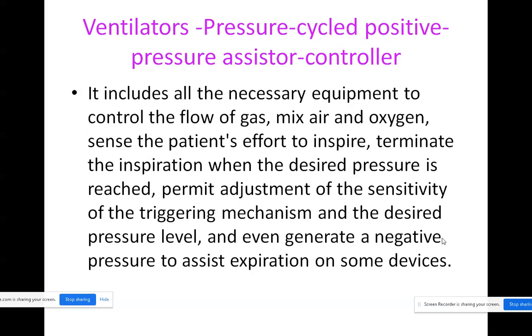Okay, it will be controlling the oxygen flow, and also mixing the air with the oxygen. It will also be sensing the inspiration of the patient. How much the patient is inspiring, that will be sensed. Based on that, it will provide the gas to the lungs, and it will also terminate the inspiration whenever the desired pressure is reached in the lungs.